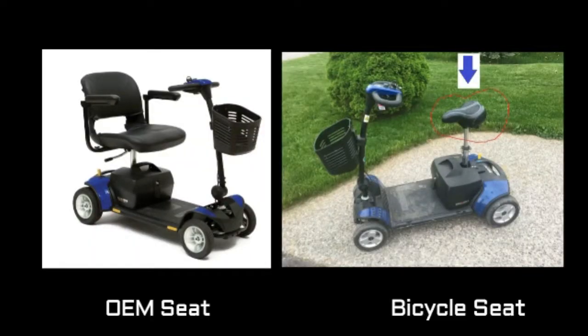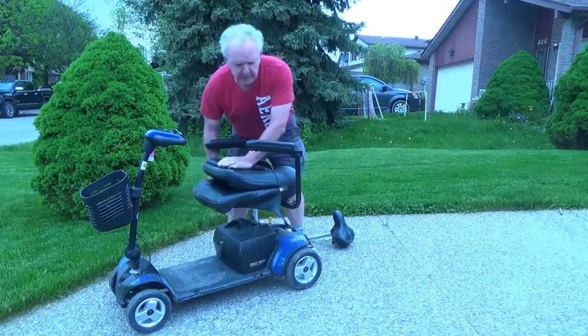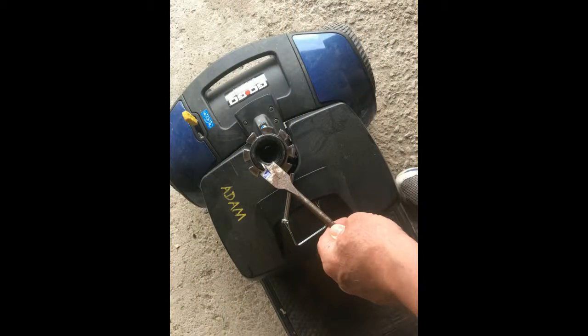Should you want to go back to the original equipment seat, this is how you would do it. That's the original equipment seat installed. One other thing to mention: there's a plastic bushing in the middle of the post. It's supposed to be one inch across, exactly like the bicycle seat post, however it's a little bit too small. To fix that, I took a one-inch drill bit and reamed out the edges. The original equipment seat fit better after that, and of course the bike post fits better too.